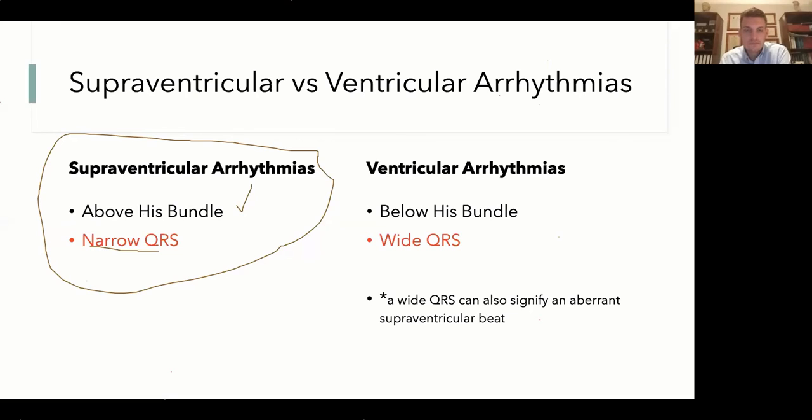Yeah, I can see. Give me a second. Okay, so supraventricular arrhythmias will be above the bundle of His, and they will have a narrow QRS.